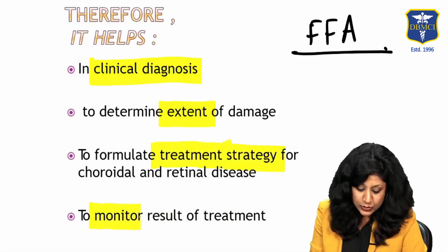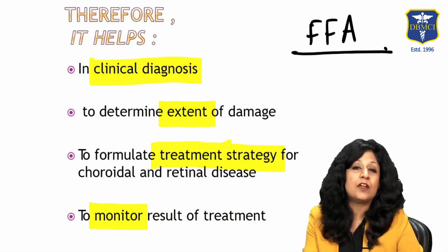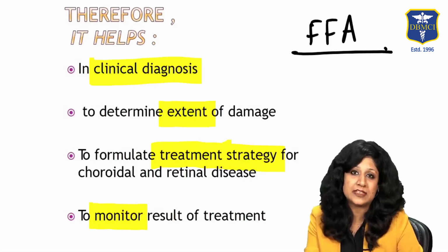And also it is used for monitoring. What was the severity before and what is the severity afterwards? When I want to see the treatment guidelines, how it has been treated, what the prognostic value is, I want to do the monitoring. In that case also, I will use this angiography.